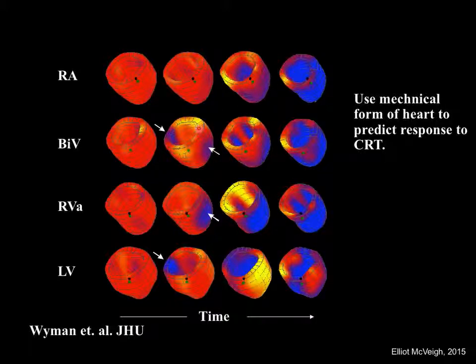You can make very accurate three-dimensional maps of myocardial strain under different conditions. And so this is time along this axis. The dot represents the septum, and we see the evolution of shortening, which as the tissue gets circumferentially more short, the color scale goes blue. Let's do this one, it's simplest. This is right ventricular apex pacing. We have a pacing lead on the ventricle right here. And so we pace the heart from that location and do the same tagging experiment.